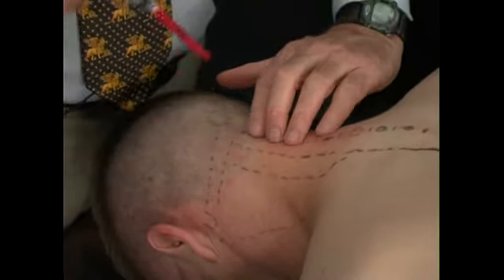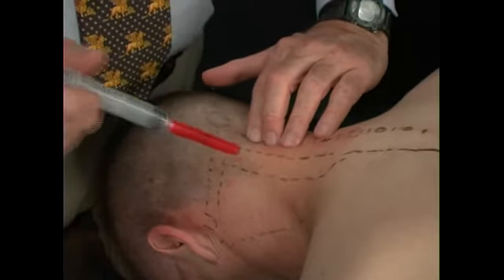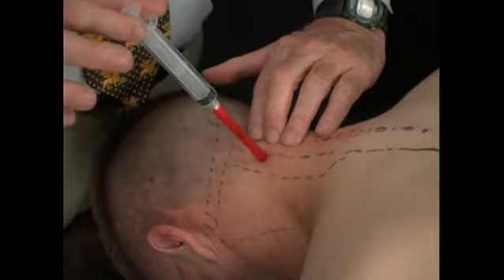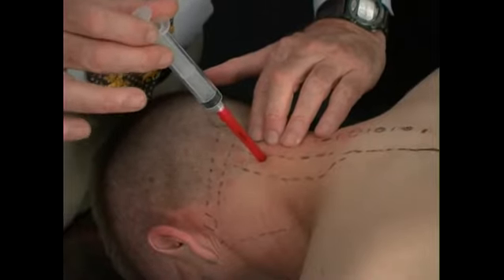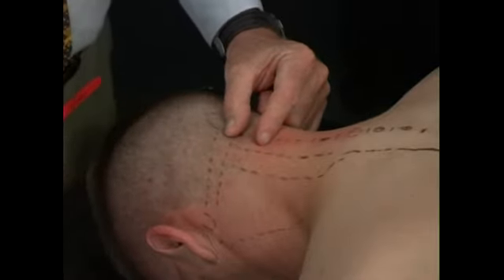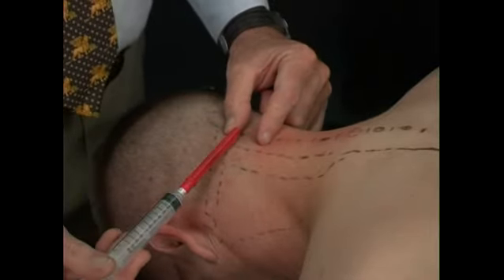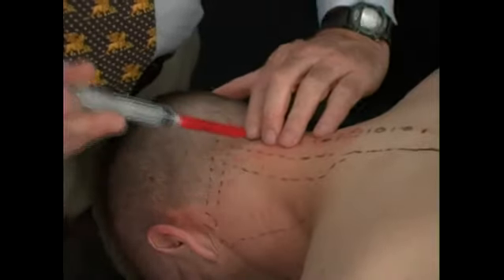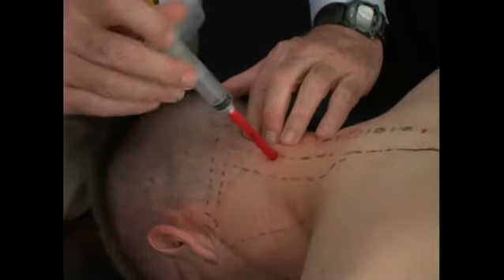In this area, we place our fingers on the spinous processes, and then we come in with our injection at approximately a 30 to 40 degree angle, going straight down, making sure that we're below C2 with this. We know that there's open space above C2, so we want to be at C2 or below. C3 is even safer in this area.